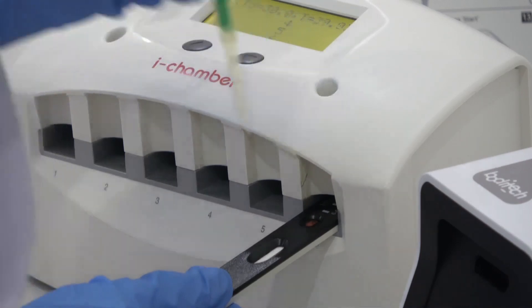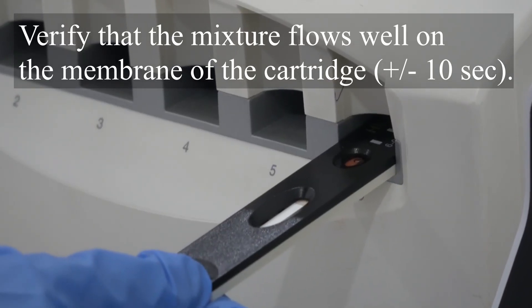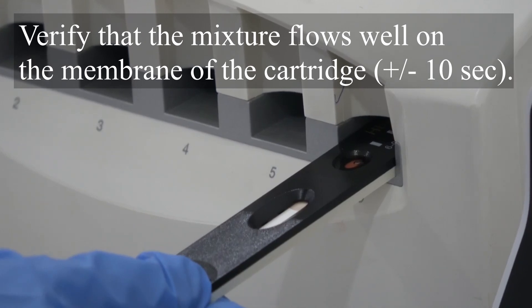Verify that the mixture flows well on the membrane of the cartridge, which takes about 10 seconds.